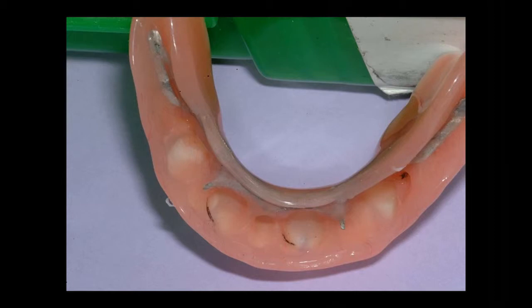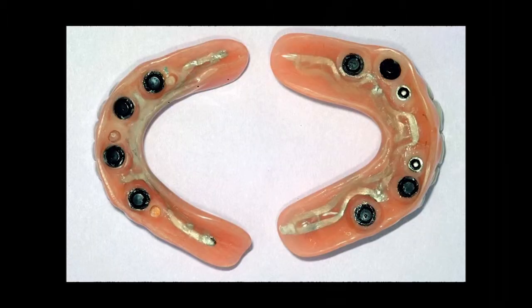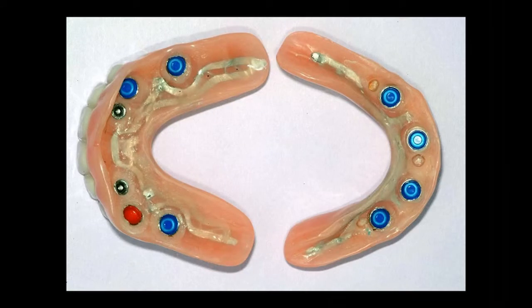And then finally, go ahead and cure these into place with quickset acrylic. And this is just the final deal. Like I said, I'll send them home with the black ones, and then we'll upgrade to blue. Usually 4 blues is plenty.